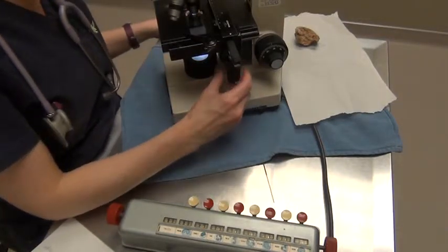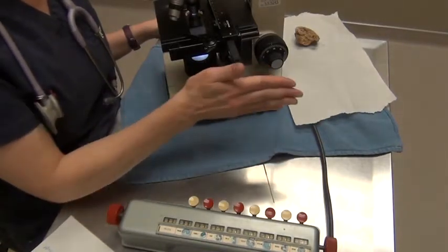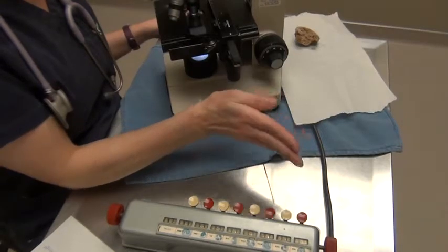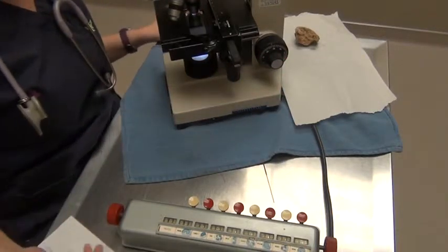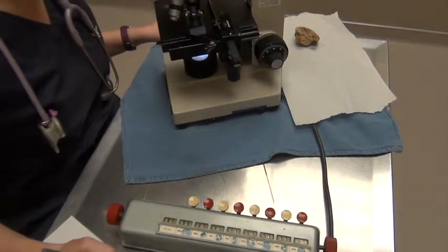So I'm going to go ahead and keep in the same direction. I don't want to go back over and count where I've counted, so keep in the same direction, and you can change forwards, side to side, but you certainly don't want to zigzag all over the place. You need to keep a constant direction. So I'm just going to go ahead and do some platelet counts. And this machine does not cover counts, so I'm just going to do these by hand.